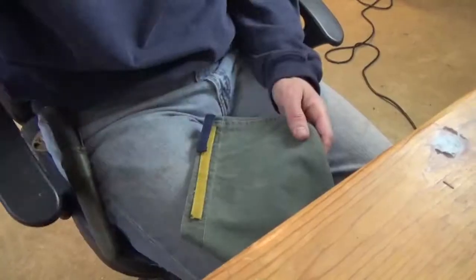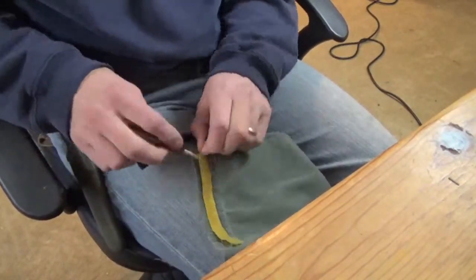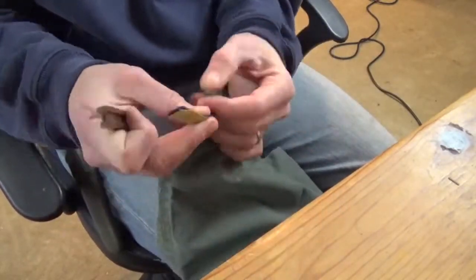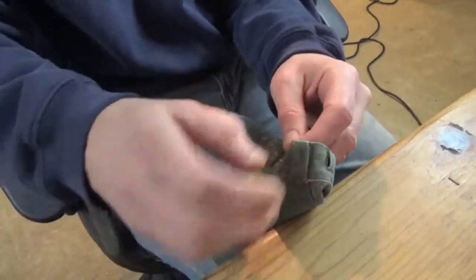Okay, well, the first thing I got to do is go ahead and get some of the old details off of this particular pants leg. A couple pieces of Velcro here, old strap, whatever. Just get that all cleaned up and get that out of the way.